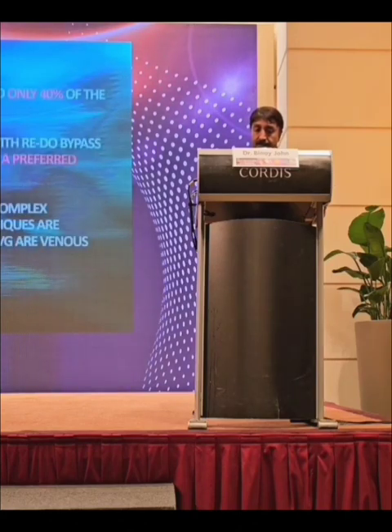So here the stent is being positioned. I did a shot after pulling the wire actually. And once I was convinced with the position, I deployed the stent. This is one of the shots, and this is the final shot, and the kink has disappeared. And there are no pseudo kinks because I chose the shorter stent. So this is the final result.